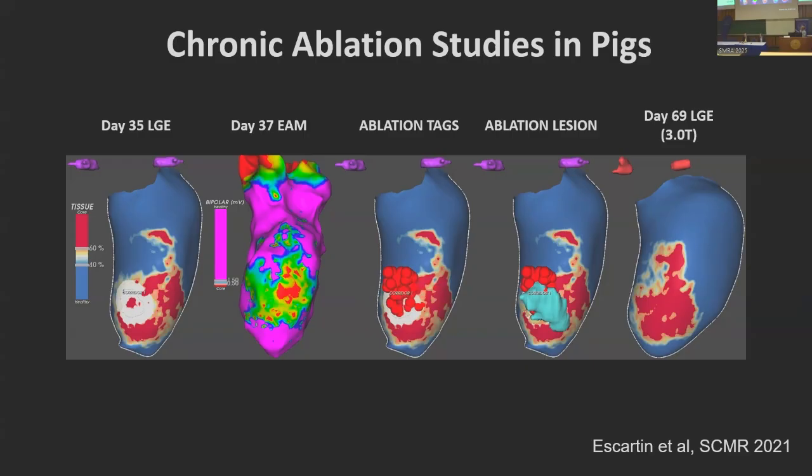And that blue in the next image is the segmentation of the native T1, showing that we basically got the right spot and targeted that area of heterogeneous infarct. More importantly, here's what the scar looks like 5 weeks later, where we've turned that heterogeneous infarct into dense scar. So just conceptually, there's the workflow.